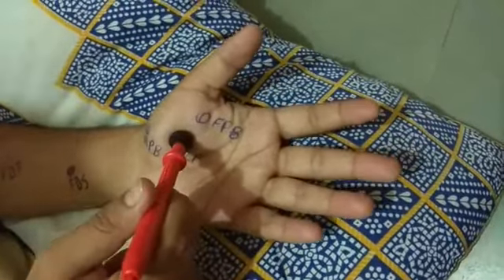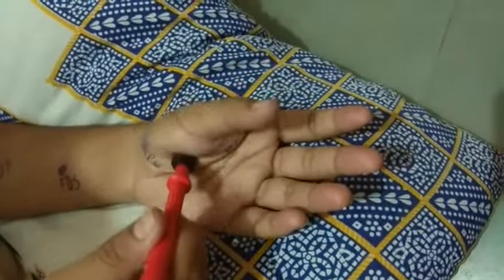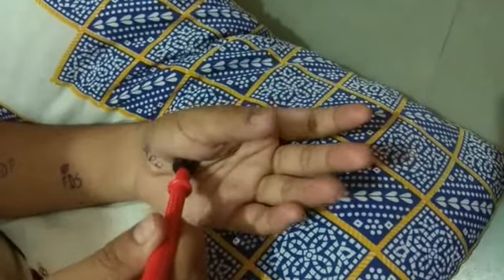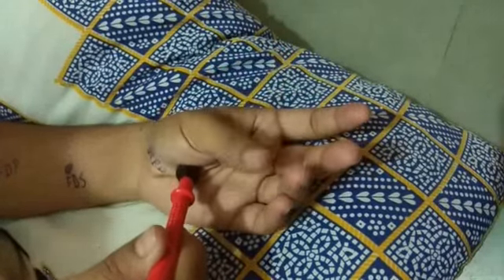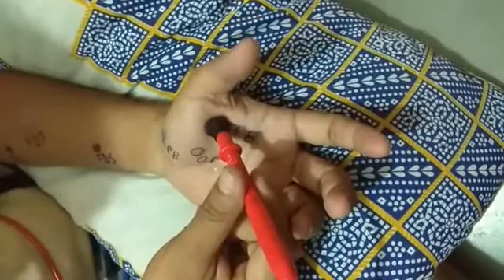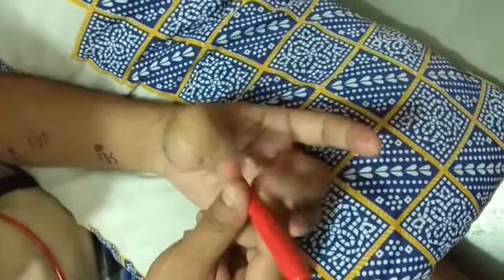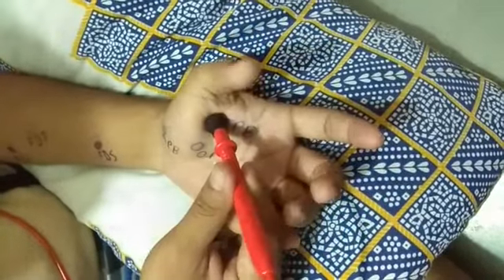This is the motor point of the opponens pollicis. The action of the opponens pollicis is opposition. This is the motor point of the flexor pollicis brevis muscle. The action of flexor pollicis brevis is flexion of the thumb.